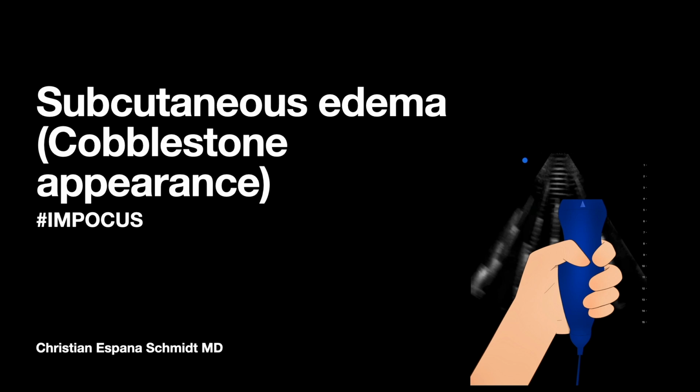This video is about subcutaneous edema or cobblestone appearance.